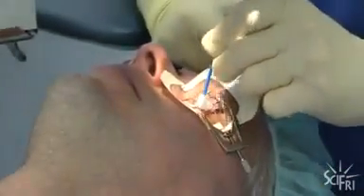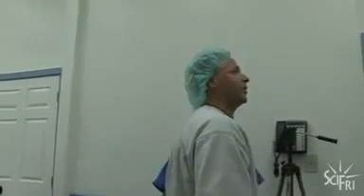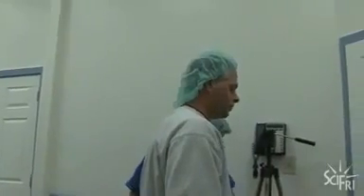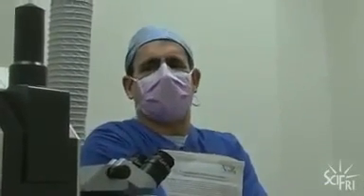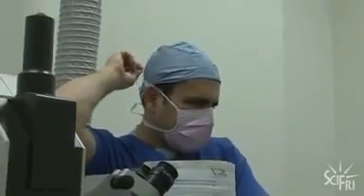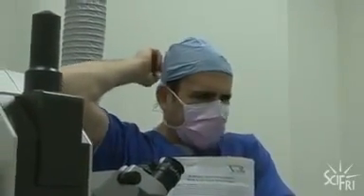After ablating, Dr. Vail folds the flap down. Then we use a sponge again to smooth the flap out and put it back where it belongs. That piece of tissue is actually a natural bandage. Now, Dan, would you have been able to see that flap without your glasses before we did your treatment? No. I mean, it is like I'm underwater though. Exactly. The effect you get is really pretty much immediate. There's a little bit, because there's swelling, that people think that they've been in the swimming pool too long afterwards, but generally it's really gratifying for patients in particular to know that they made the right choice, because as soon as they get off the chair they can see better already.